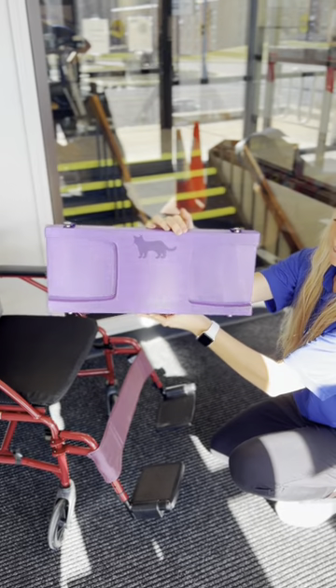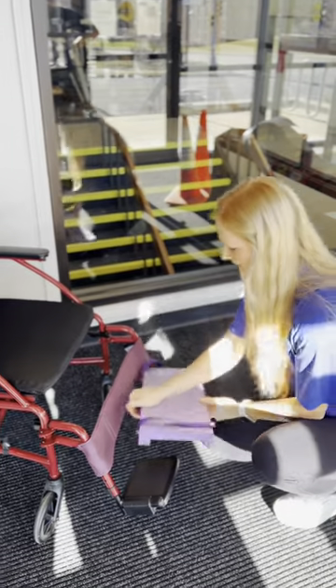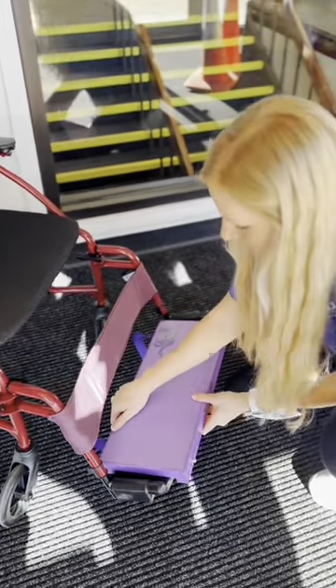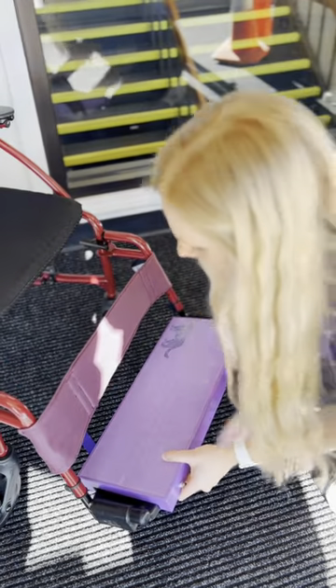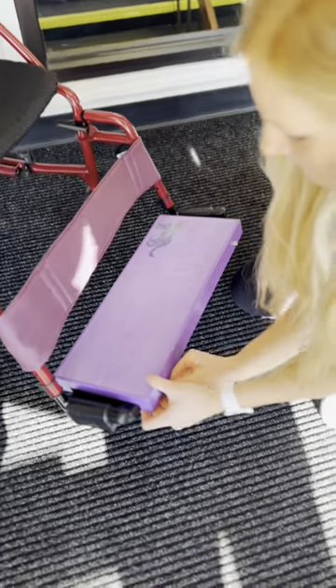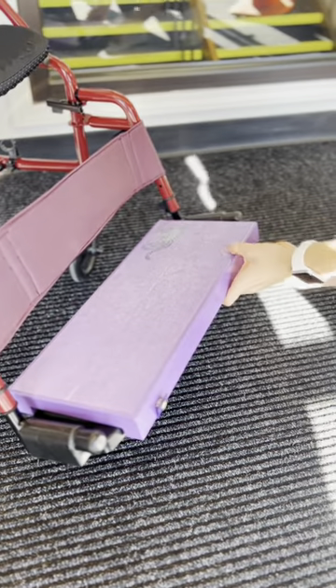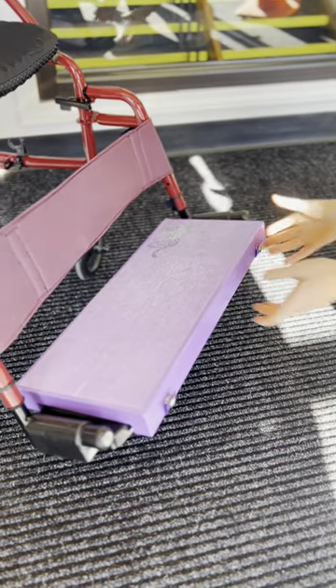The footrest is made of wood, which was sanded, coated, and painted, with anti-slip tape added to provide durability and support. She previously had a board attached to the footplates; however, it was not a stable surface. The footrest fits the foot pedals and snaps on to stay securely in place.